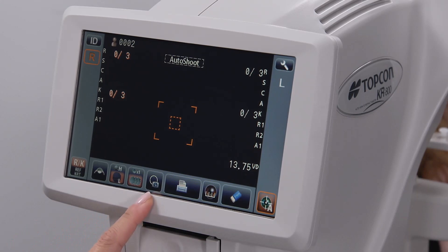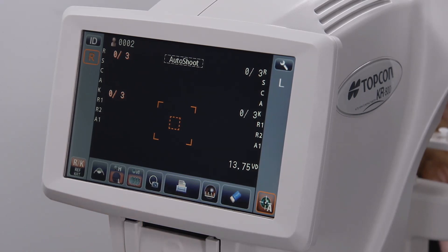The image icon will provide a photo of the eye that was acquired during the testing. If the corneal mapping mode was active on the KR800PA, this icon will display a corneal map.